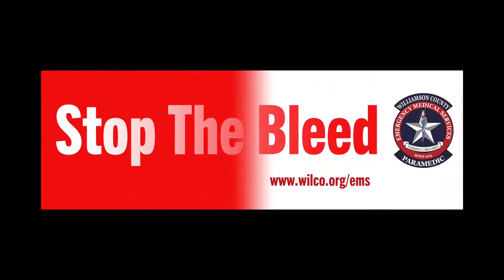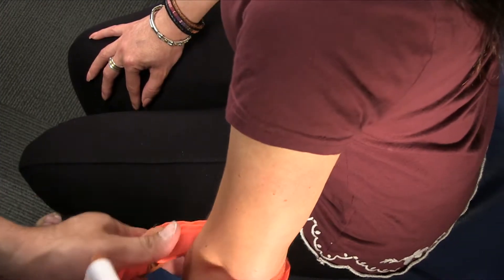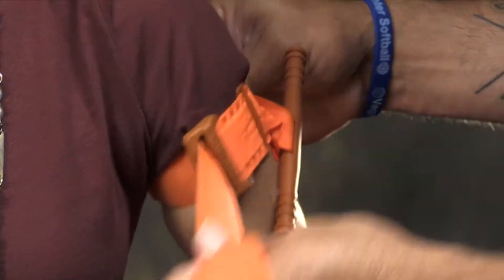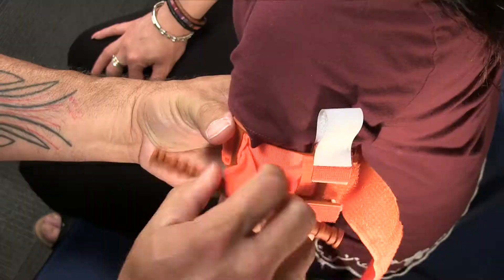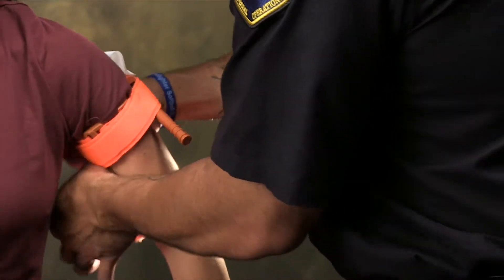Welcome to Williamson County EMS Stop the Bleed Skills: how to apply a tourniquet. Tourniquets are used on arms or legs to control major bleeding. Remember, high and tight placement of the tourniquet — doing so ensures the tourniquet is above the wound, not on it or below it. Tourniquets are painful but should never be loosened or taken off after application. We will be demonstrating the use of a CAT tourniquet.